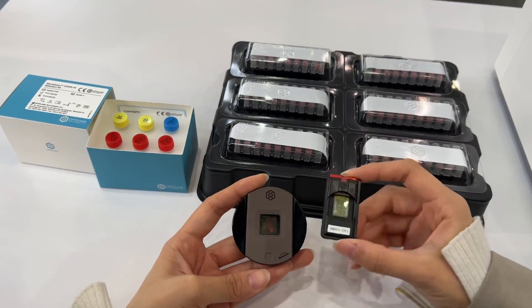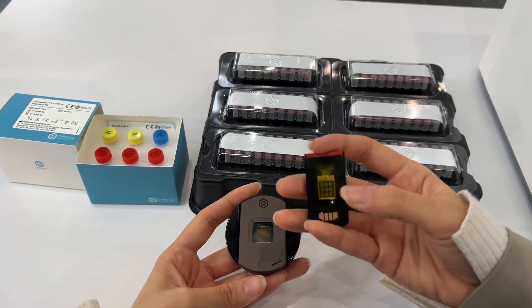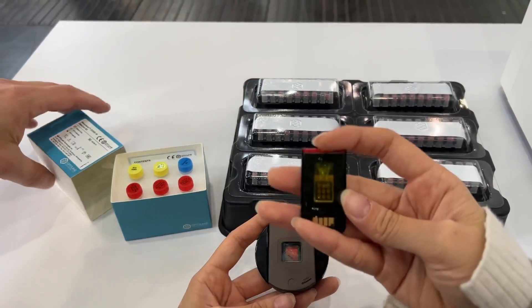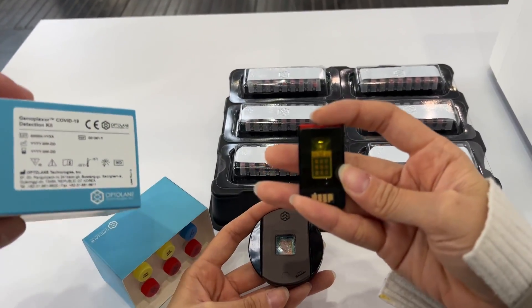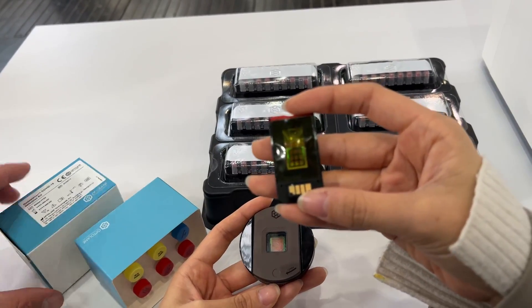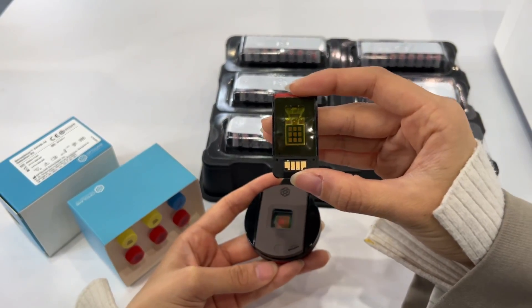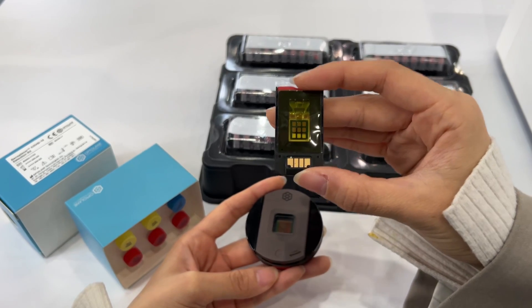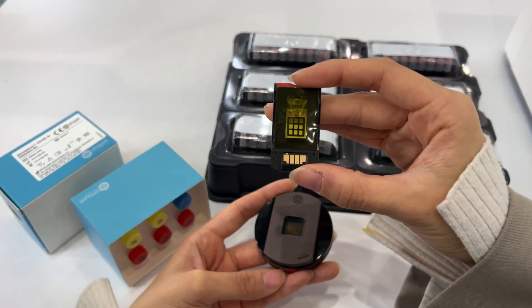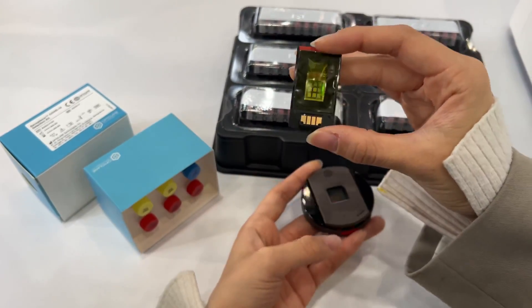So it is very cost effective. On the back side of it, we have nine wells. One of the wells will be used as a PCR-C, so a positive control. For the other wells, primers and probes of the target genes are already lyophilized and spotted into each of the wells.